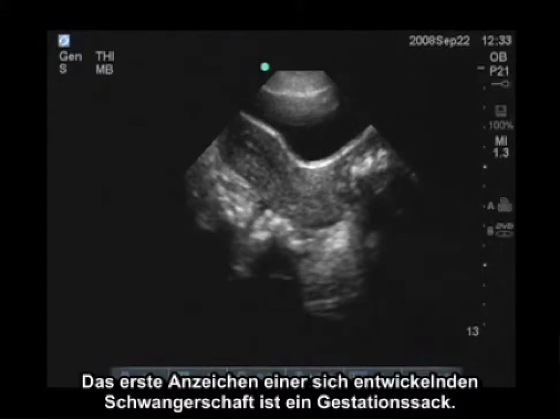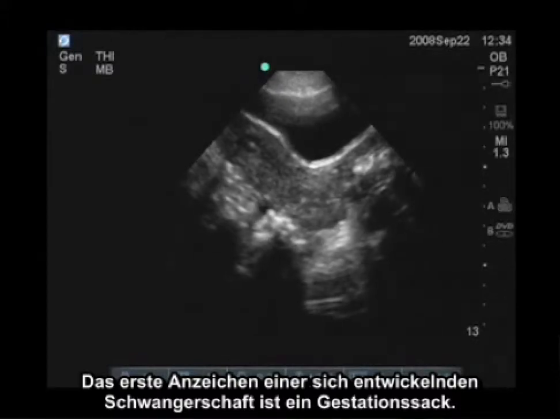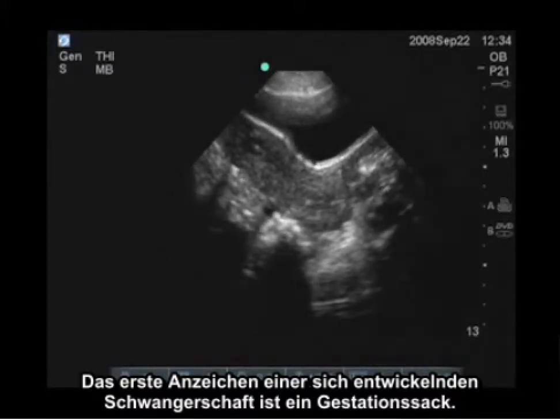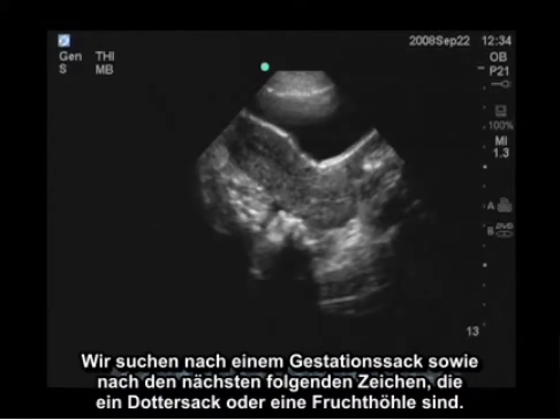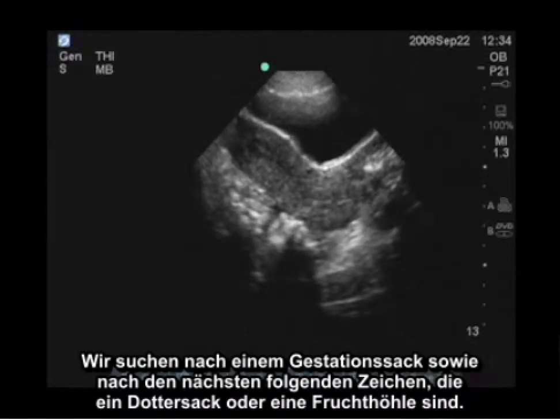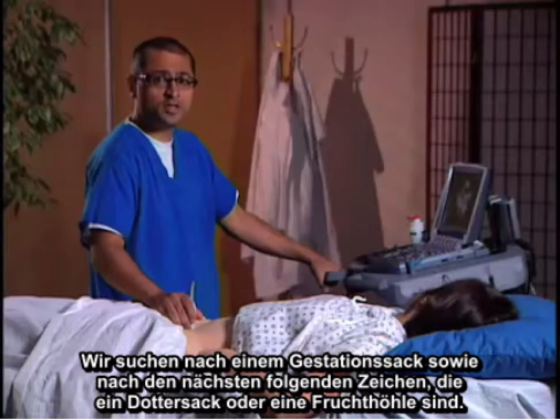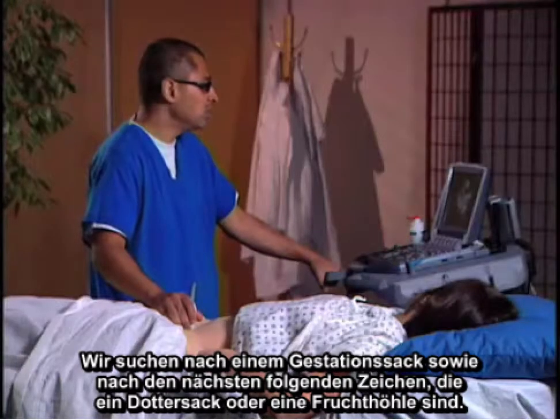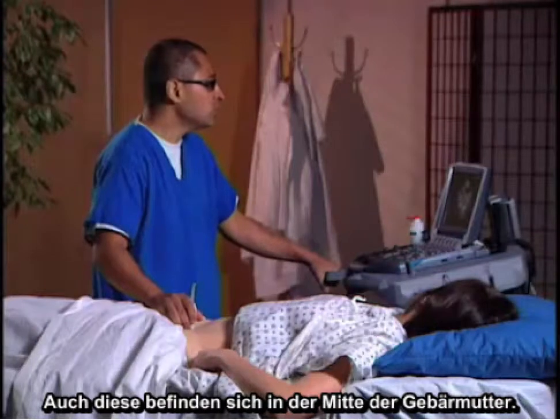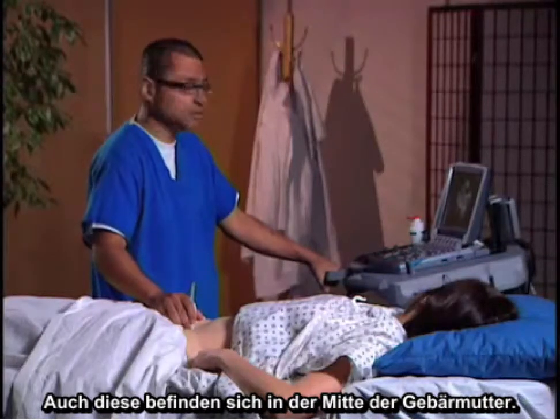The first sign of a developing pregnancy is a gestational sac. We're going to look for a gestational sac, as well as the next subsequent signs, which would be a yolk sac or a fetal pole. Again, these would be located in the mid-uterine position.